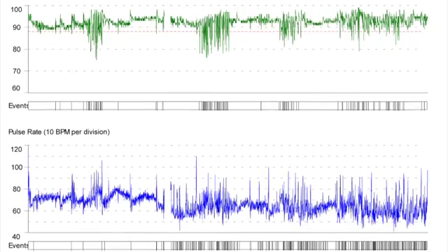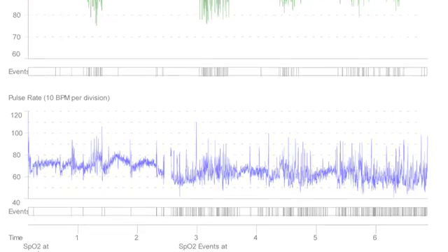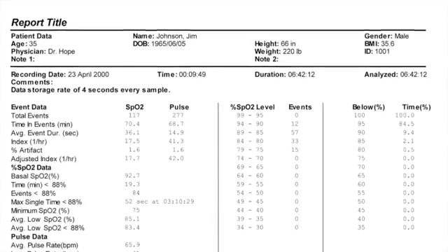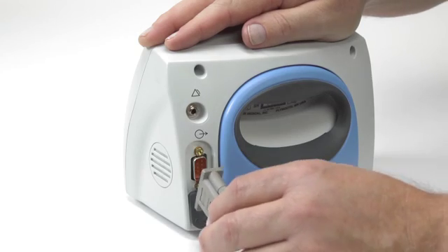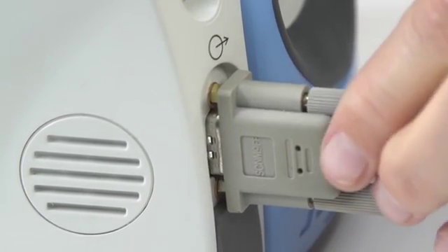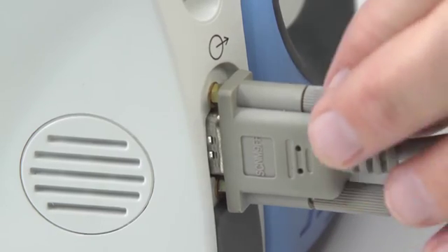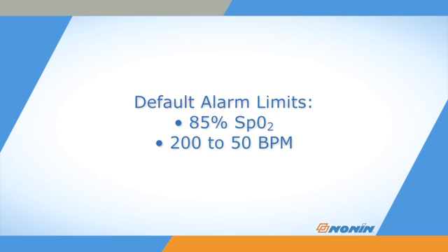The Avant 9600 stores at least 115 hours of continuous arterial oxygen saturation and pulse rate data. This data can be transferred and analyzed in Nonin's N-Vision software via a modem cable from the oximeter to a computer with N-Vision installed. The Avant 9600 oximeter comes with a default low alarm setting of 85% SpO2, a high pulse rate of 200 beats per minute, and a low pulse rate of 50 beats per minute.